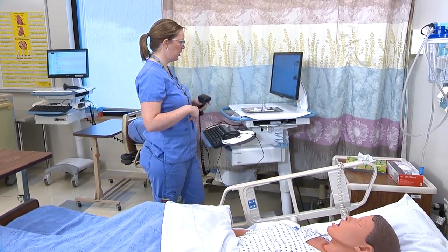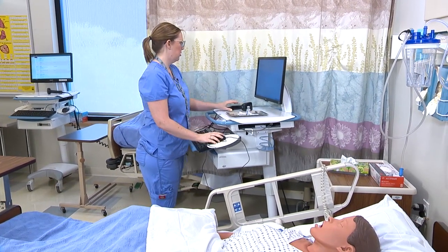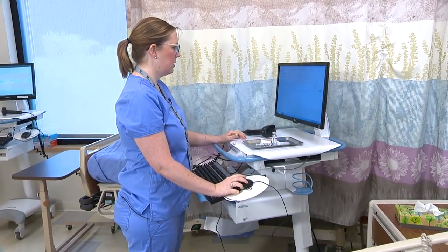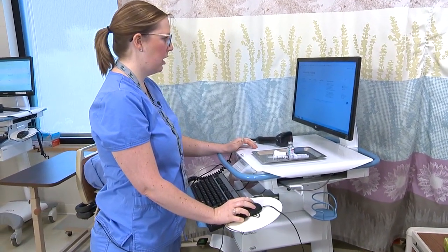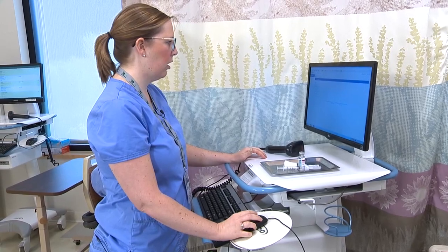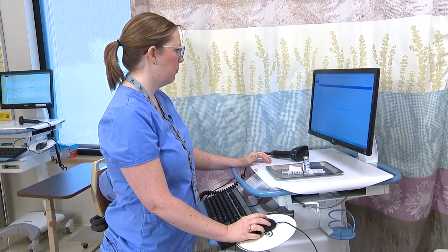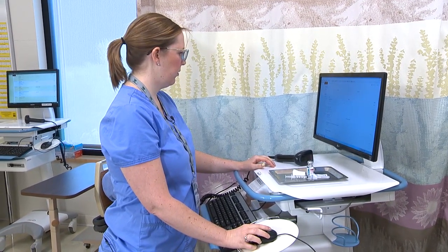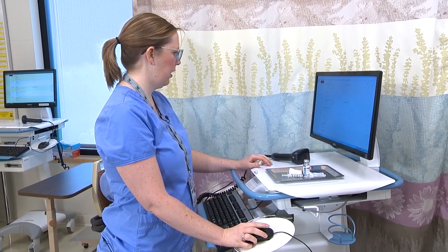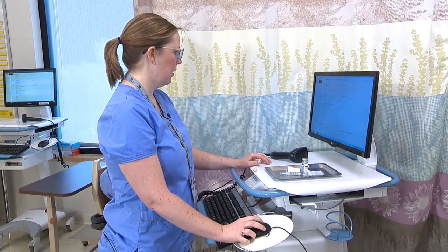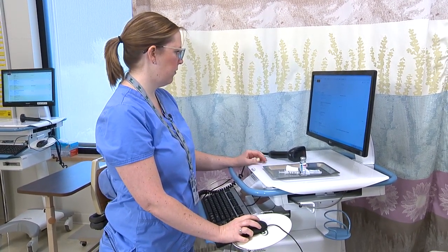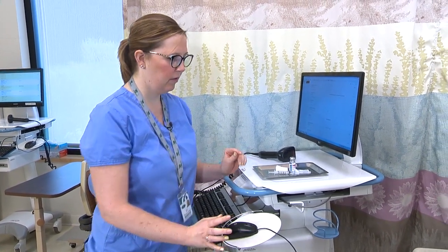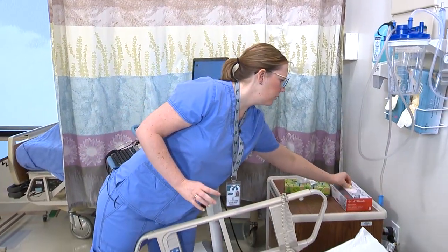I'm going to log in here. So today we're going to give this shot in your gluteal area. I see I have an order here for the pneumonia shot — it's due today at 10. Let me grab some gloves.